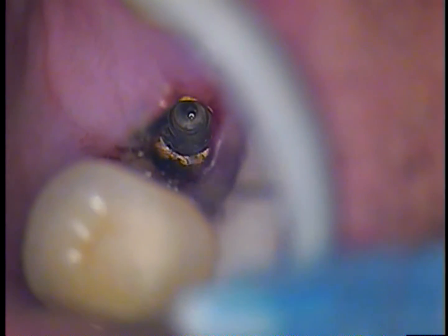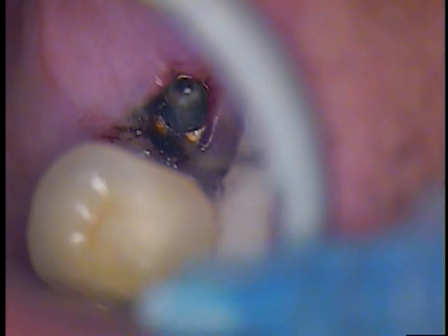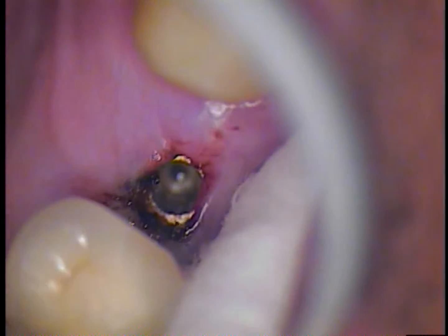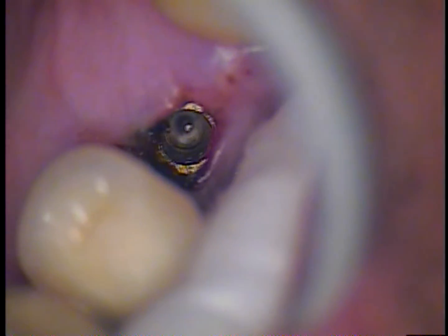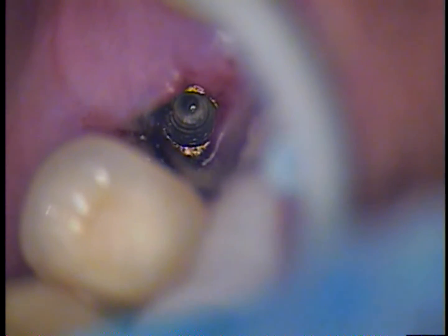I will have to check with the companies whether or not peroxide can be used with titanium. Going in and just putting a little bit of tartar and stain in there very gently. You can see it is a color-coded light blue syringe tip — blunt, nothing sharp. Right now it is just a matter of scrubbing.